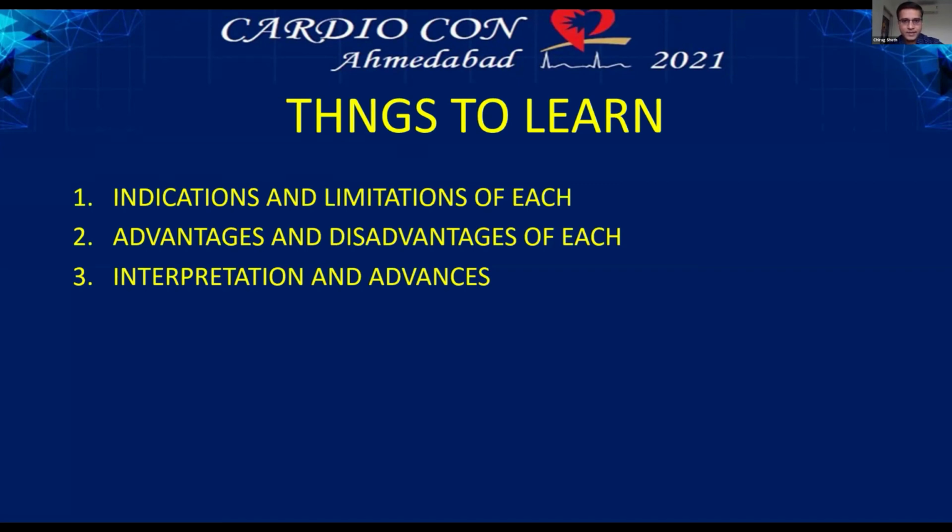Thanks, Dr. Mahesh. Any comments from your side? Can I change sides? Sure. So the new form of IVUS has got a fabulous thing. It is called angio-co-registered intravascular ultrasound with tri-co-registration with the FFR. So you get FFR, you get IFR, you get angio-co-registration, and you get the IVUS images all in one place.